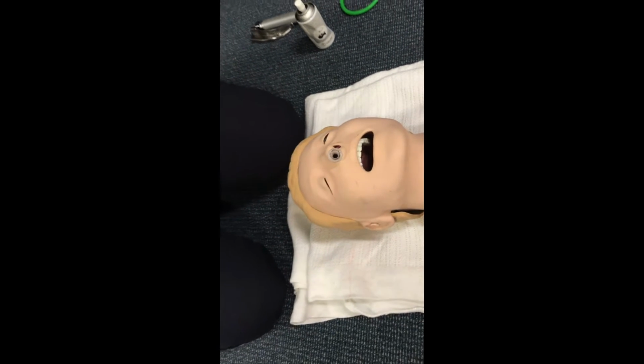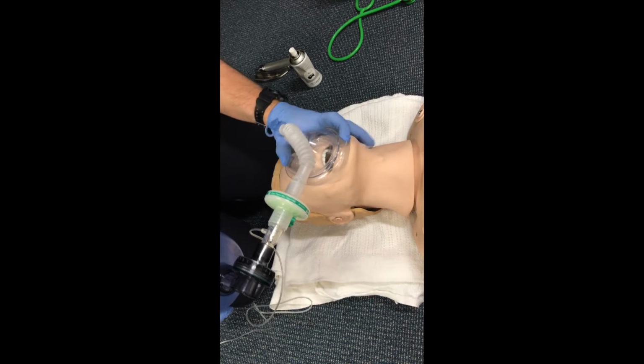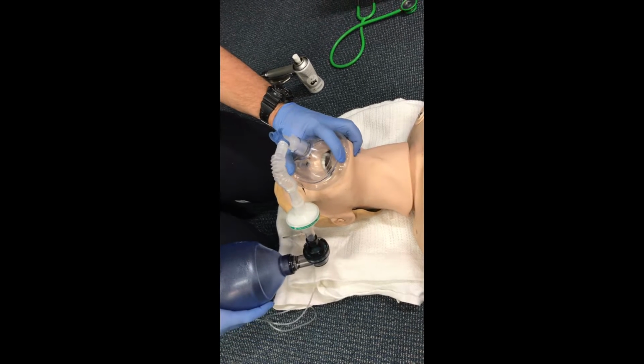Insert the NPA to the measured length. From here, apply your BVM, gently assist some ventilations if required, and look, listen and feel for chest movement for adequate ventilation.